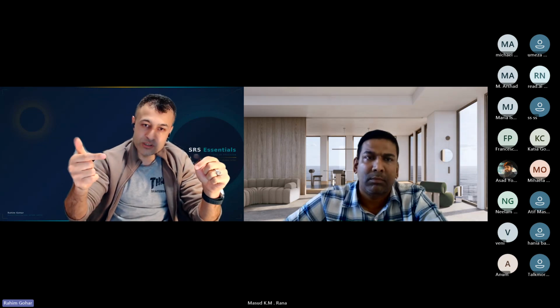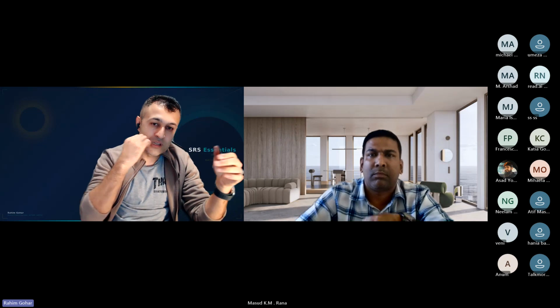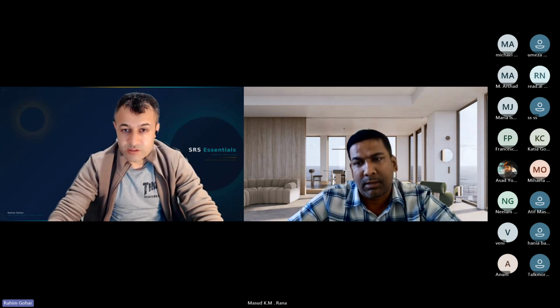So therefore 1 millimeter. But we know there is uncertainty in the film, therefore that uncertainty budget is higher. In the case of the SRS MapCHECK, we use 3%, 1 mm, because it is more robust, and the SRS MapCHECK is good.